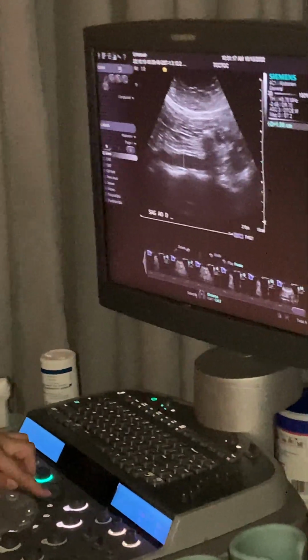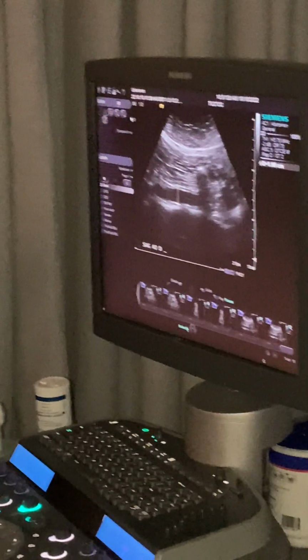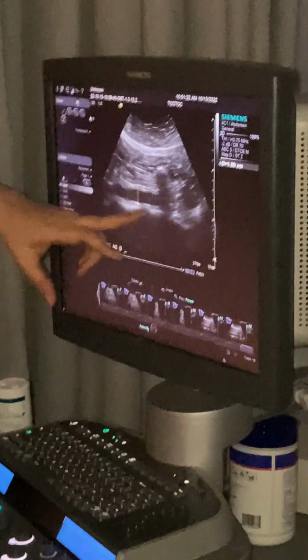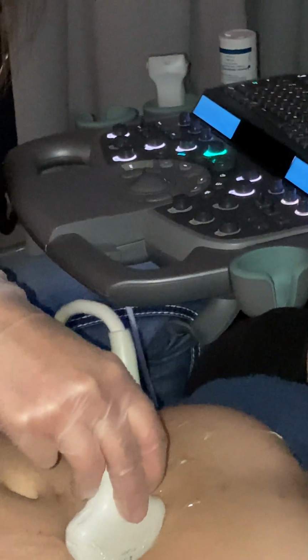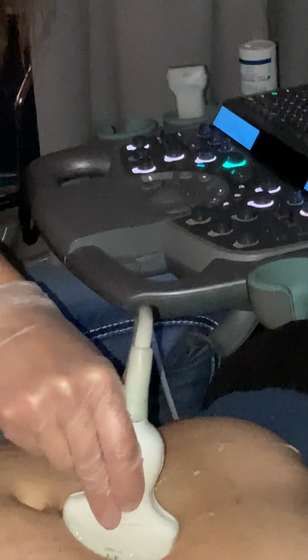If we're standing really in the middle, could we say which is the right and which is the left iliac? So we'll get into that in just a second. That's usually going to be where the bottom of your transducer is pointed. If it's pointed towards your left leg, it's your left iliac. If it's more pointed towards the right leg, it's your right iliac.